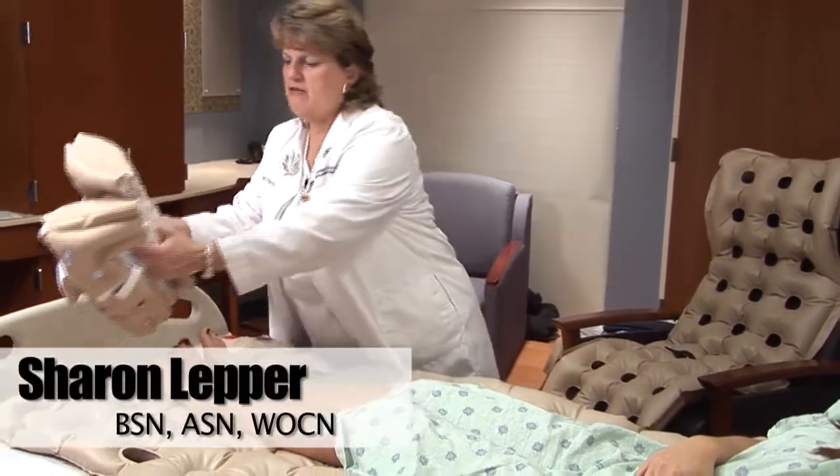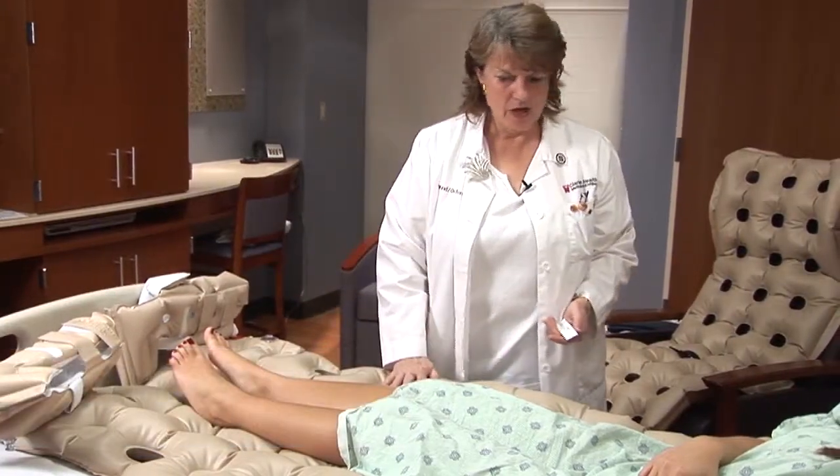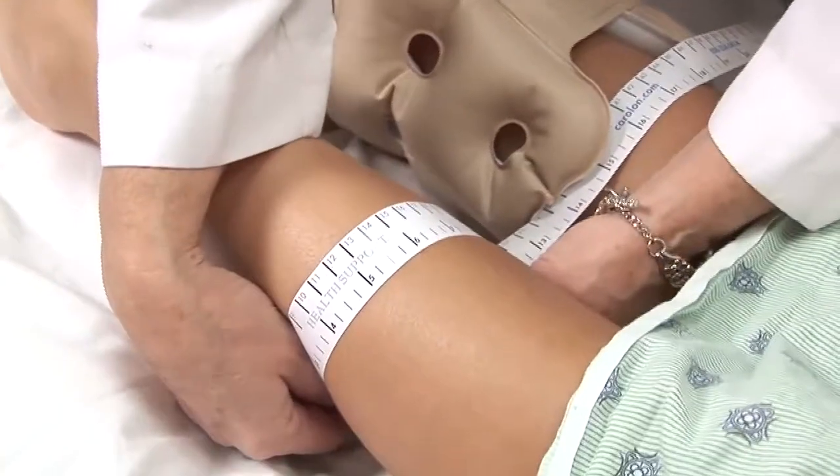The waffle boots have air redistribution capabilities, just like the mattress you're lying on. I got the right size because I measured your calf first and then picked the appropriate waffle boot to fit you.